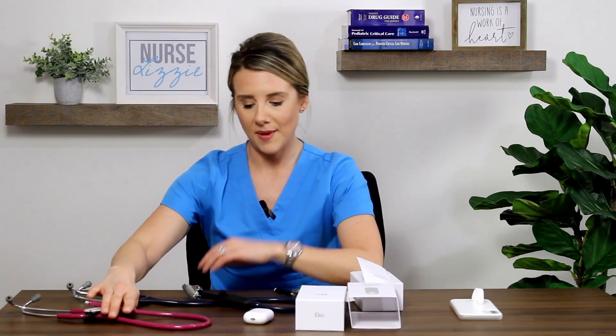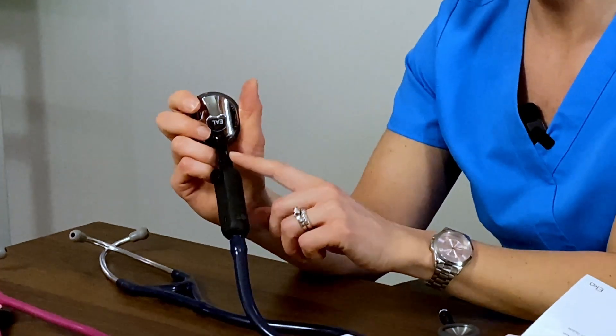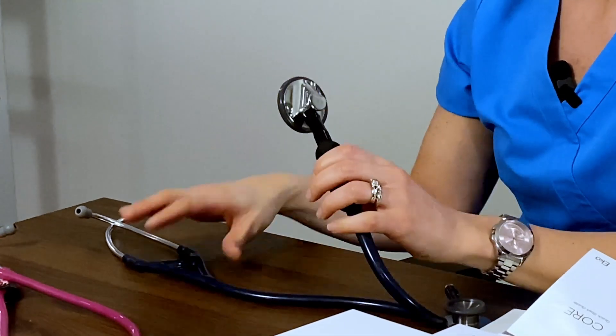There are nice controls on here: a circular button to record, a plus sign to amplify the volume, and a minus sign to decrease the volume. As I mentioned, there are two different connectors — standard and pediatric. I initially hooked everything up using the pediatric connectors, but I changed my mind. I'm wearing blue, so I went ahead and put my standard connector on my cardiac stethoscope. I'm all ready to go and put this to use.